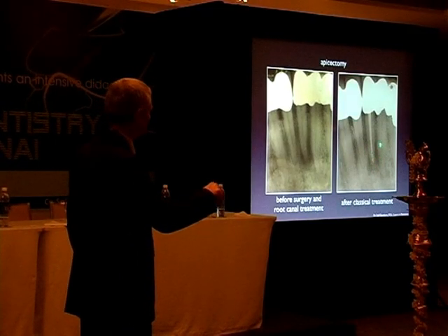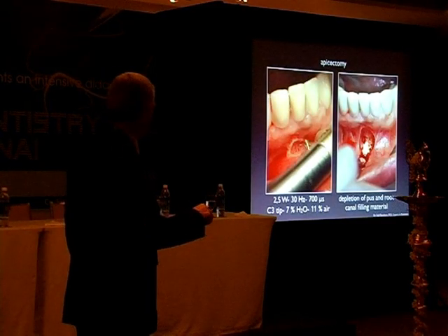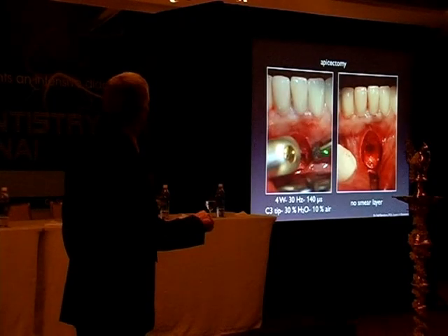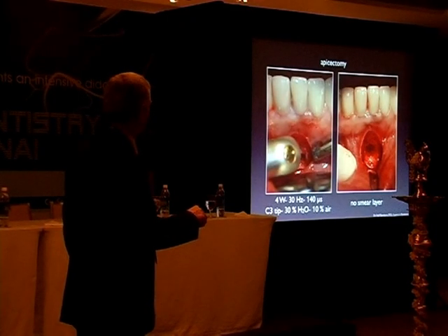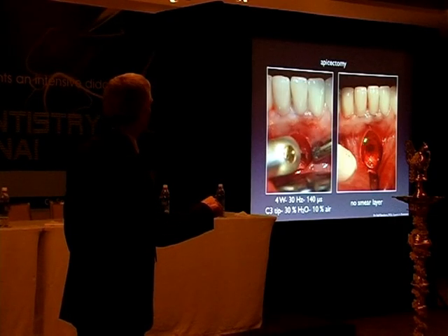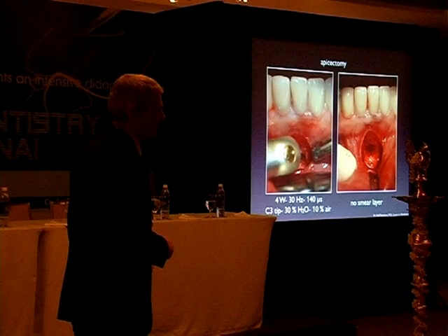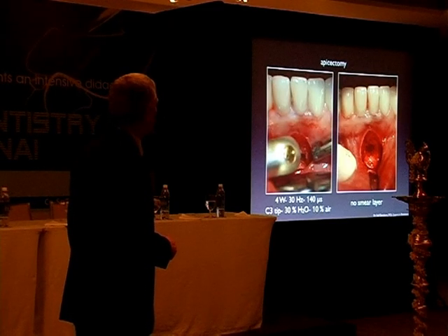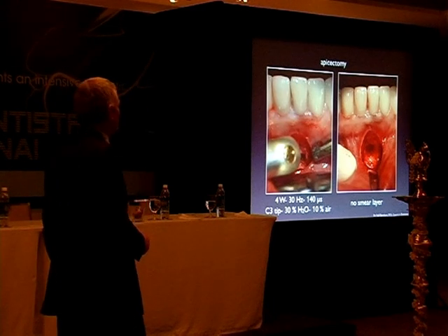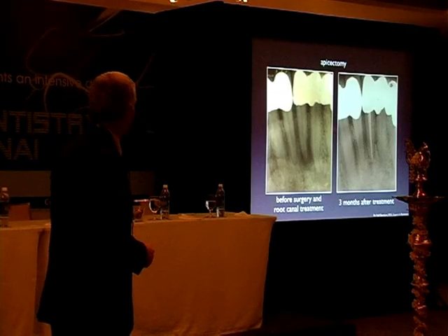There is still an osteitis there, so we start to treat it with erbium laser, long pulse for gingiva, short pulse for bone and for apex. You see it's absolutely free of smear layer and of fragments, and absolutely free of granulated tissue. So you get a very, very good result and a very good long-term result.